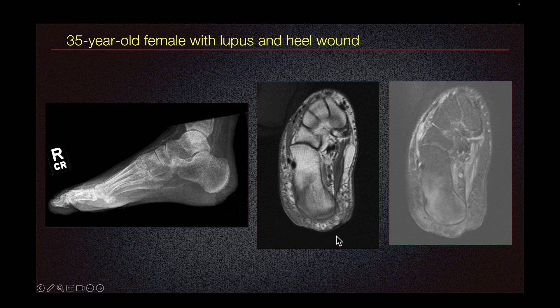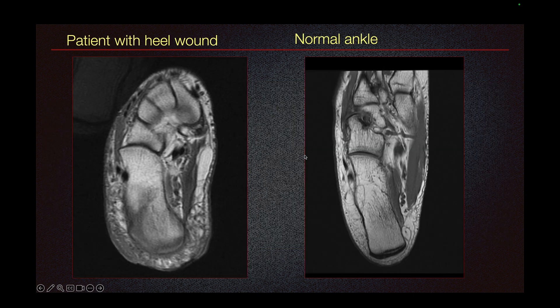This is the T1 weighted image. This is T2 fat sat. The bright signal on T2 fat sat indicates bone marrow edema. Normal bone marrow should appear dark like this. On T1, this T1 hypointense marrow signal corresponds to osteomyelitis. Normal signal of bone marrow should be like this on the T1 weighted image. Here we can look at osteomyelitis in our case versus normal MRI on the right.